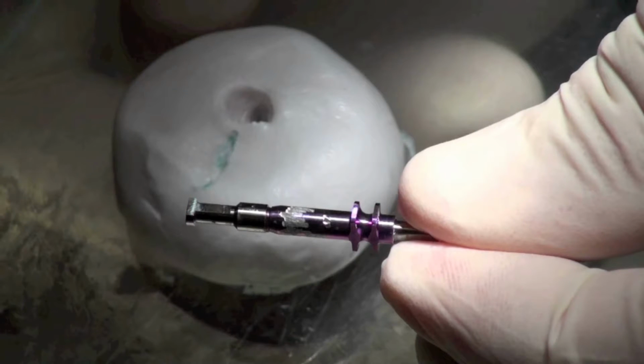You can see one of the Nobel Active impression copings. I love these impression copings. They're pretty awesome, and when I say they're awesome, it's because they're long, so they're easy. They're nice for those of you, I'm 6'2" and I use large gloves, so it's nice to not have to handle small components and try to make sure they're engaging inside. The longer it is, the easier it is for klutzes like myself who need large things in their hands. Not to say we can't make the small things work, but this is nice to have.